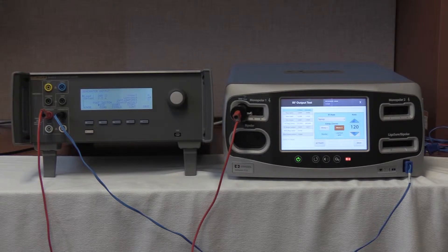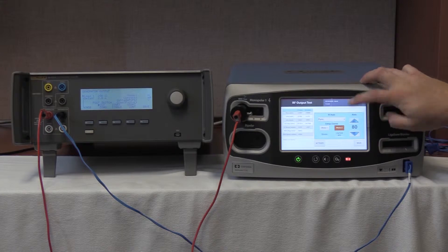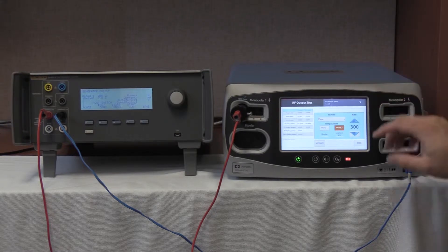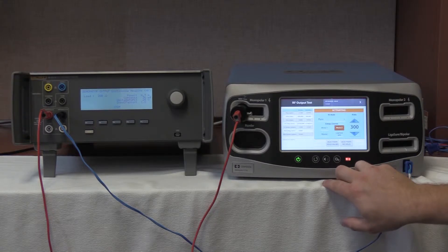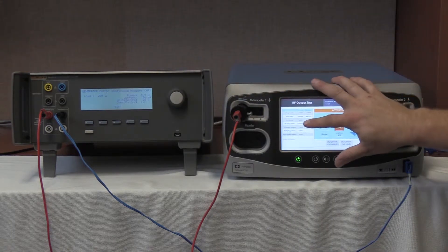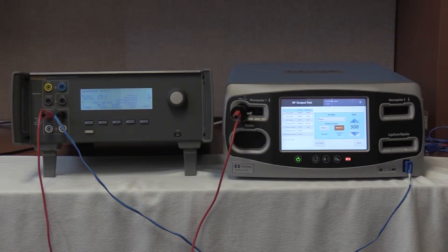Lastly, we are going to check the monopolar II cut. Hit the RF mode, select pure, 300 watts, push up arrow. Once 300 watts is selected, start continuous on the QES-3 and activate on the Valleylab FT10. Again between 0 and 150 milliamps — we are reading 36 milliamps on the QES-3, with an output of 28.6 milliamps on the FT10. Deactivate no-hold. This completes the cross-coupling leakage check of the FT10.